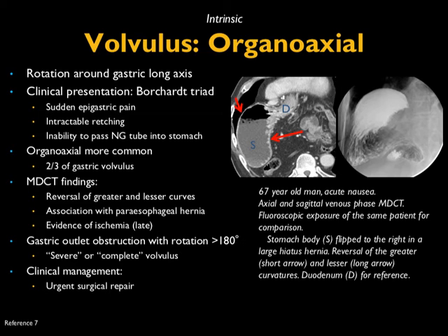There can be evidence of ischemia, though ischemic changes are usually late. The classic finding is gastric outlet obstruction with 180 degrees or more of rotation. Clinical management is surgical. In this case, you can see the body of the stomach is flipped to the right in a large hiatal hernia, with reversal of the greater and lesser curvature nicely demonstrated on CT.